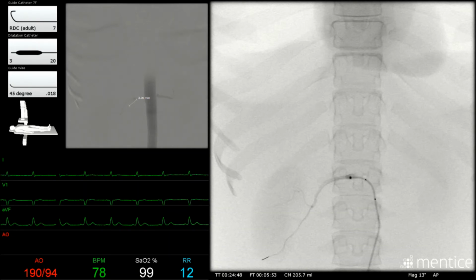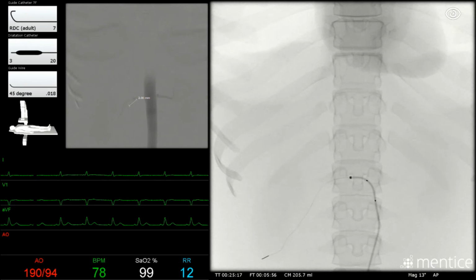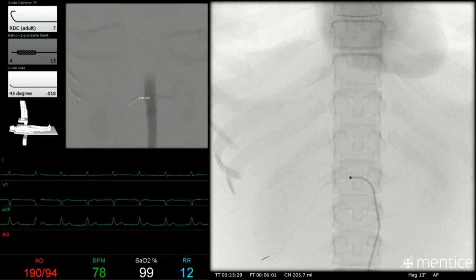You may have noticed me messing around with the reference measurement tool on the image as I explain it to you. However, I do not actively use it to size my stent, as the step-by-step guide conveniently told me which size stent to select. I eventually remove my dilation catheter and select the stent that I will be using. The stent I've selected is a 4x15mm balloon expandable stent. This means it is deployed in the artery just like how we pre-dilated, by inflating a balloon.